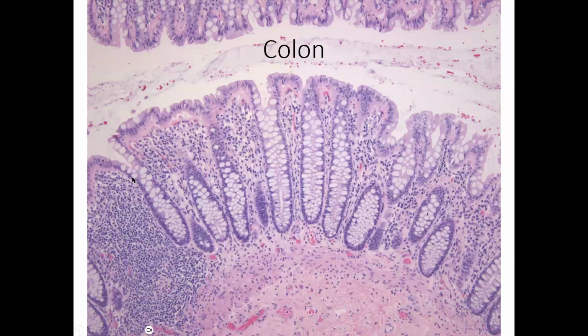On the left side here, you can see, oh, where'd the glands go there? So this is just a normal lymphoid aggregate. They're definitely present in normal colonic mucosa, so this doesn't indicate any kind of abnormality. What would be abnormal, instead of this rounded, sharply demarcated lymphoid nodule, is if you saw diffuse lymphocytes throughout the mucosa. But this is just a native lymphoid aggregate, and there's nothing to be concerned about there.